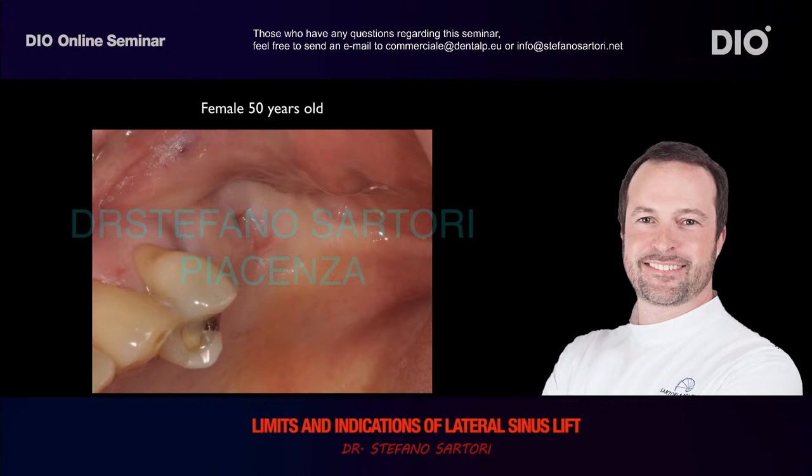Remember, when you make a sinus lift, almost always, the last tooth in the arch is the canine or the first premolar, okay? Distal to the last tooth in the arch, you always have a very, very thin crest. So, when I perform a sinus lift with a lateral approach, I always correct the thickness of the crest just distal to the last element in the arch. When you prepare the biomaterial, consider to always correct the thickness of the crest just distal to the last element in the arch. Always.